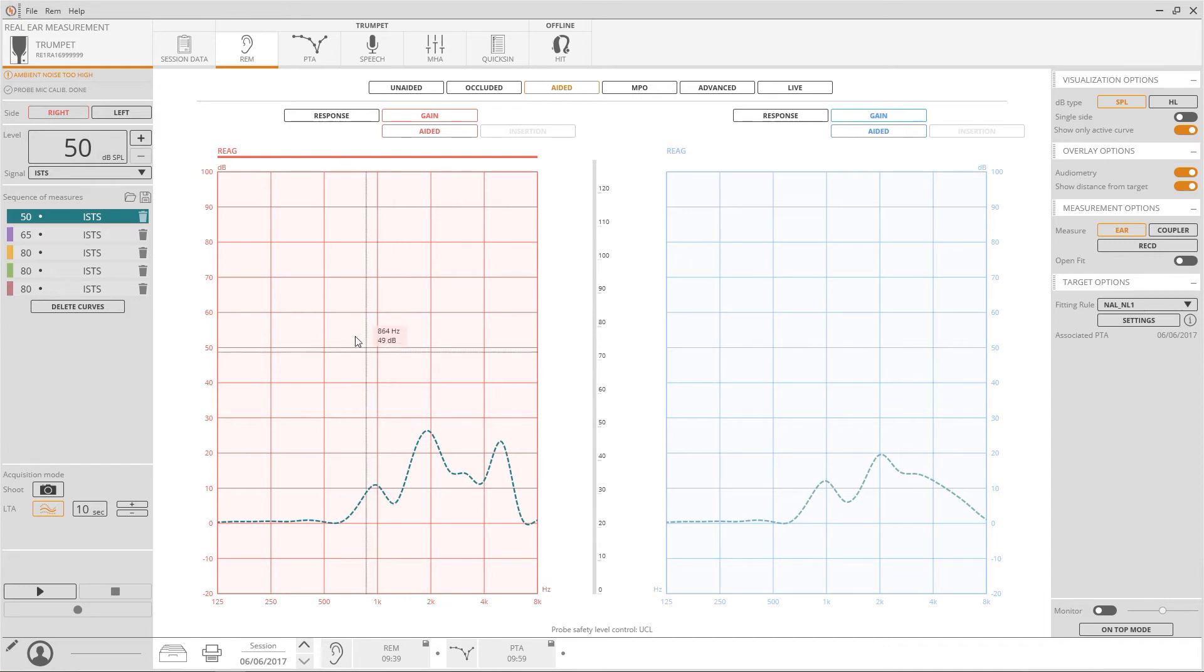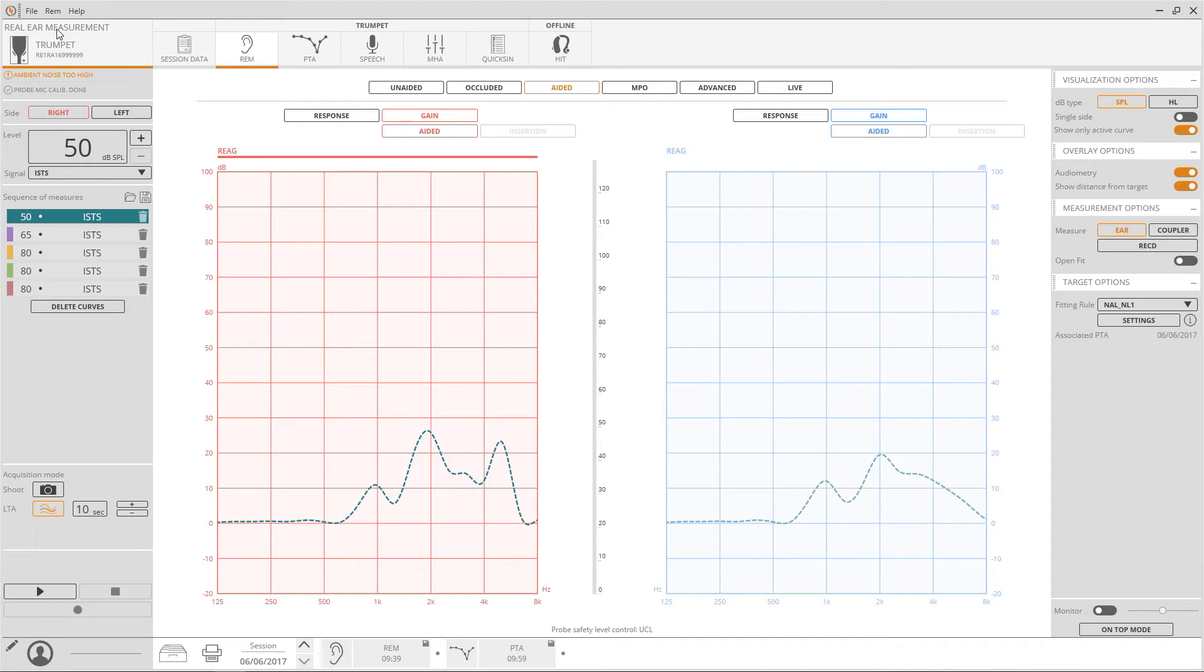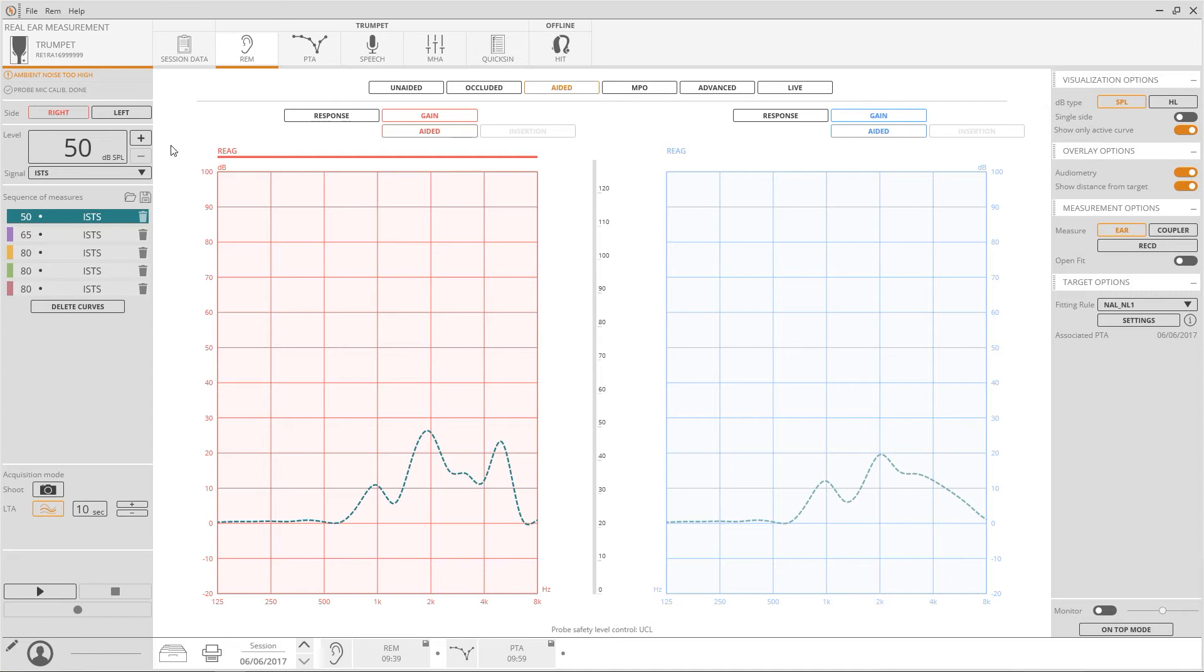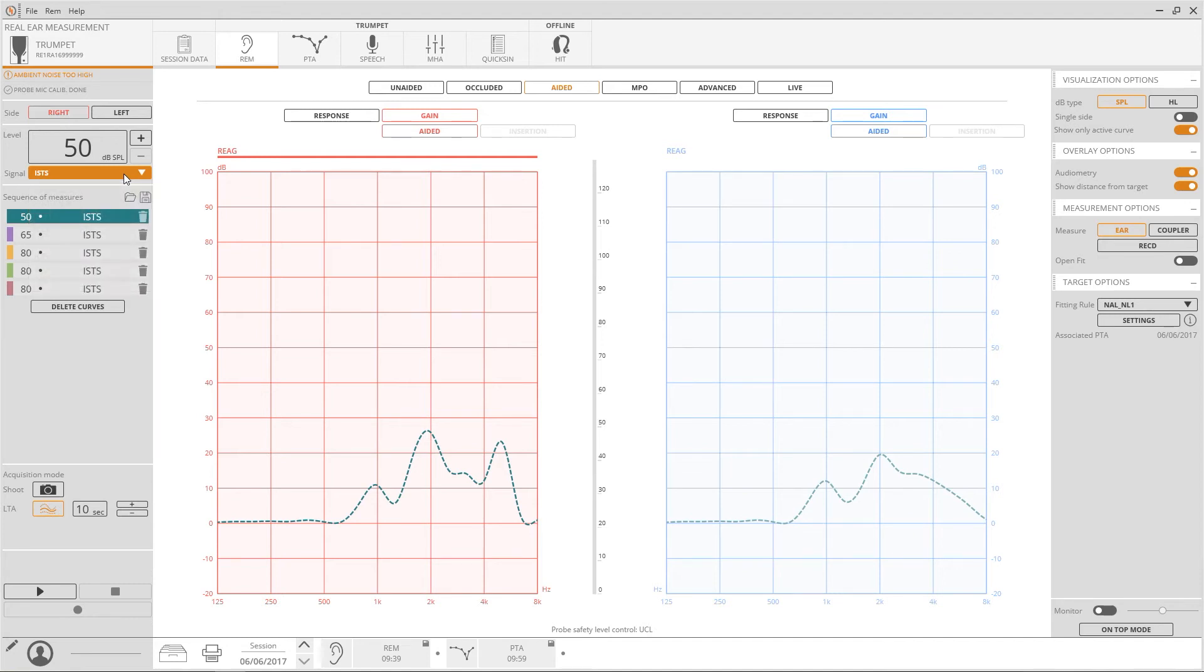Alternatively, the pure tone audiometry can be browsed and selected from a drop-down list available from the REM menu. In this section, up to five curves can be recorded choosing different intensities and stimuli. The first three, soft medium and loud sounds, is what is usually suggested.